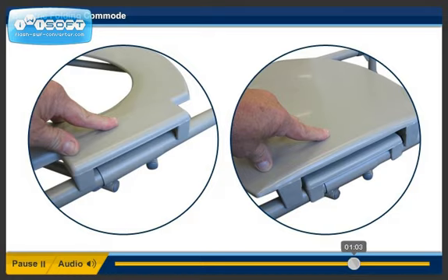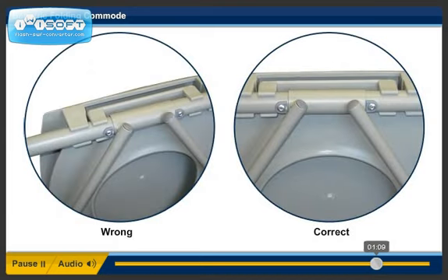Step 7. Snap the seat and cover onto the rear frame. Step 8. Make sure the seat and cover are centered on the rear frame.